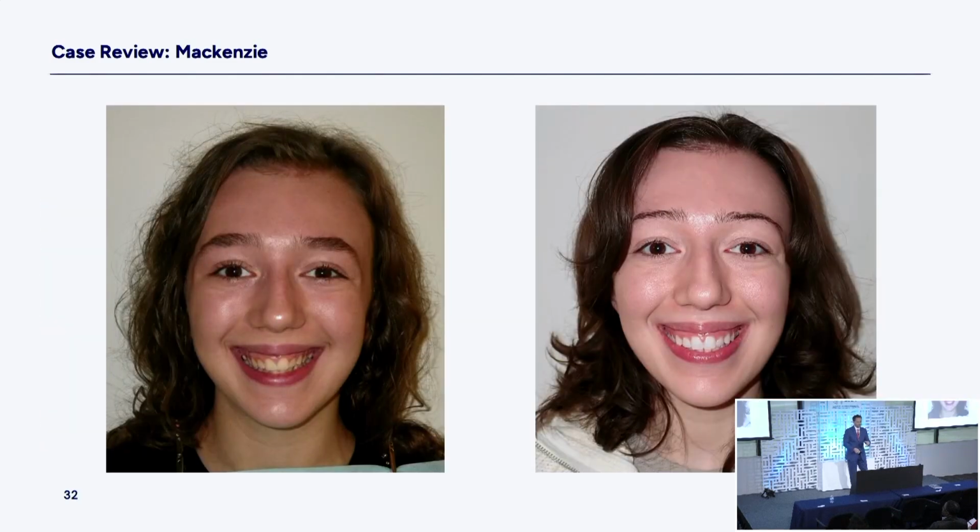So when we get to this point, we're here. But we've only done 15 aligners. Only 15. We're turning 19 years old. The wisdom teeth are coming in. We're going into it for those. We're going to capture those.